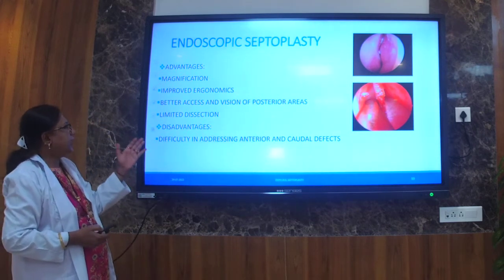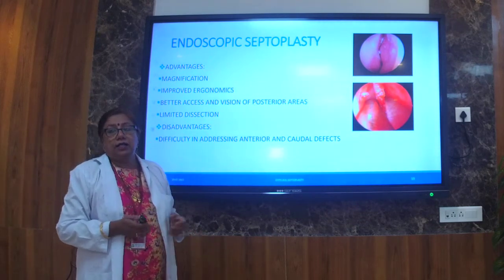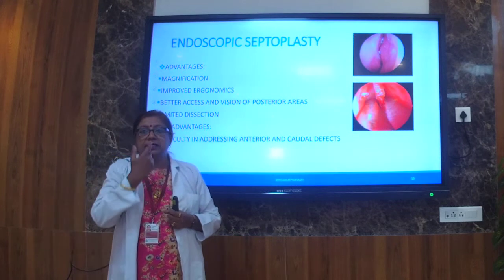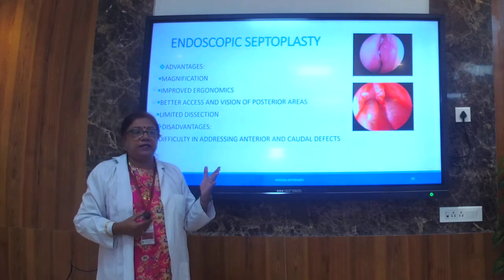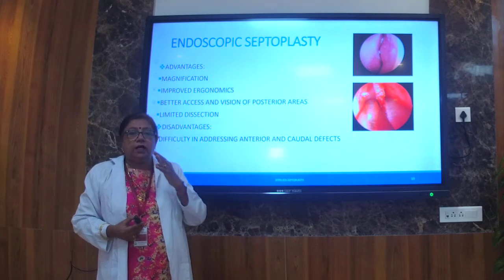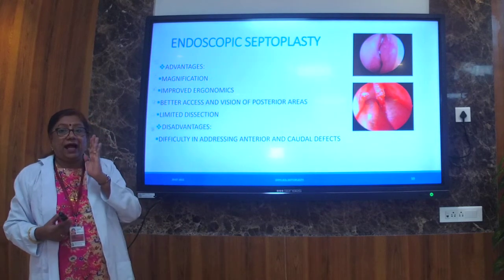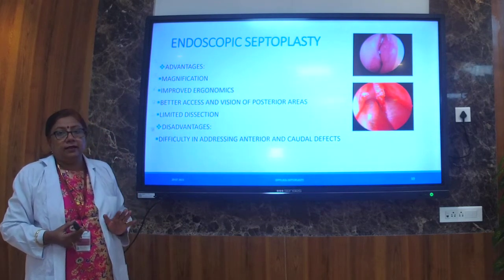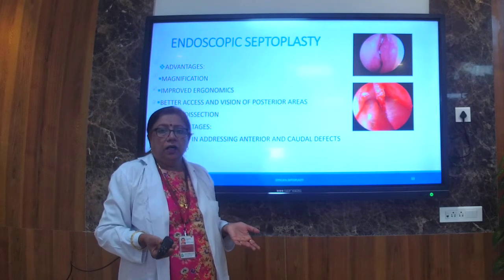So what is the disadvantage? Now all these are very good, but what happens is in the caudal area when we are operating, when we put the scope, it's very caudally, isn't it? So when we put the scope, the anterior side cannot be seen. What is caudal defect? That is the anterior deviation of the septum.